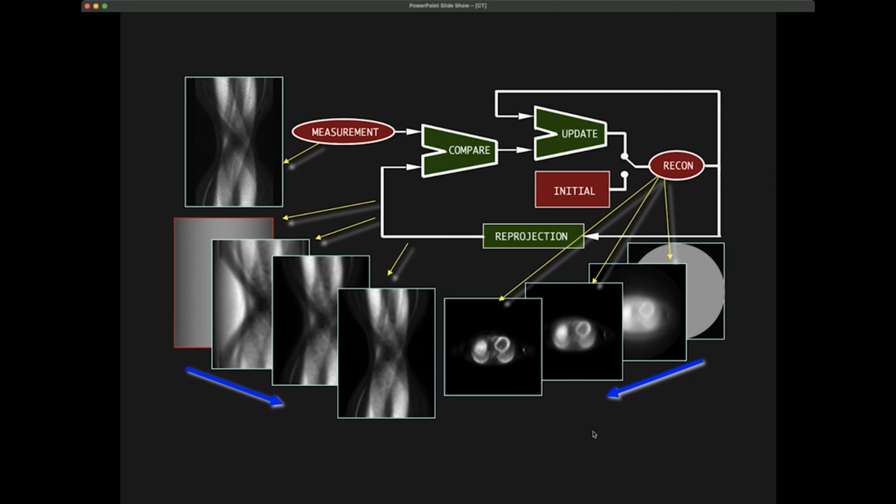Where the principle of the Fourier transform reconstruction really is mathematically correct. So there you say, okay, mathematically, what I measure is related to what I want to know, to my original distribution, through these formulas, and you calculate these formulas. What you're going to do here now is say, okay, we have a measurement. Let's try to find, however, in an iterative way, so with adapting it, what's the most likely distribution that we had that, if we would scan it, would give the sinogram.